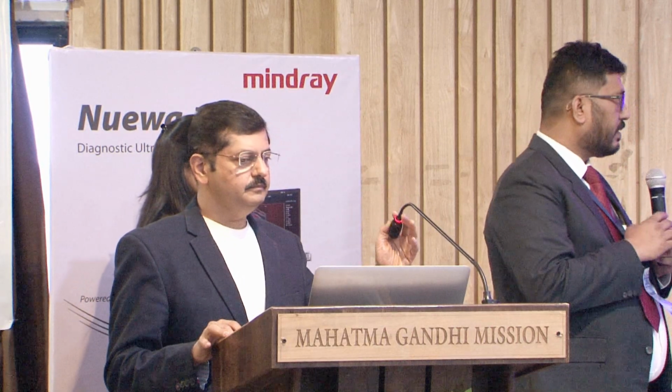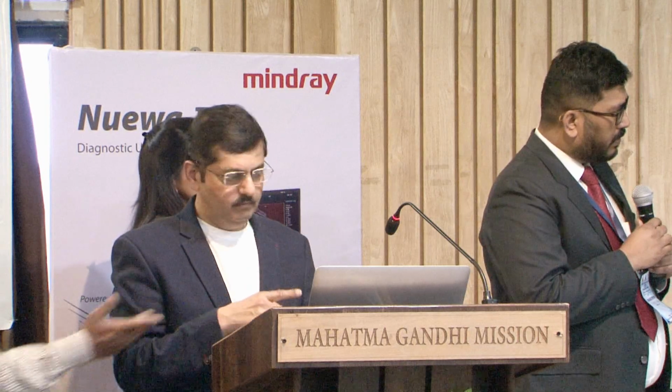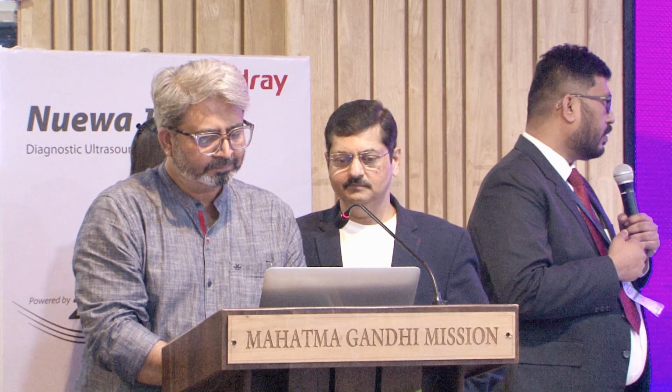What additional information do you want from us, such as whether there are any stones along the DJ stent? Yes. Whenever there is a DJ stent, if there is any stone, it should be mentioned, so that before removing the DJ stent, we can counsel them regarding a ureteroscopy procedure for the stone removal.